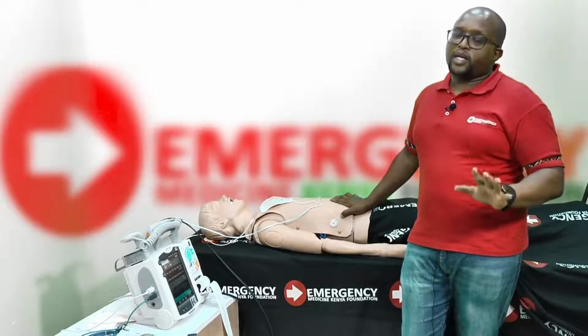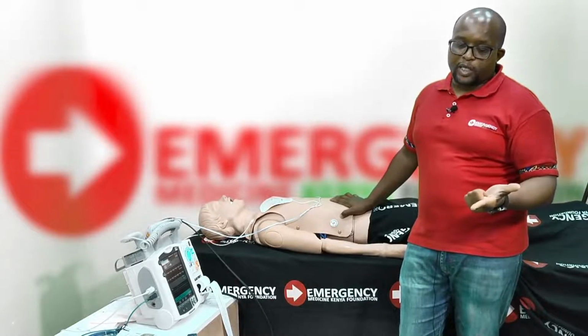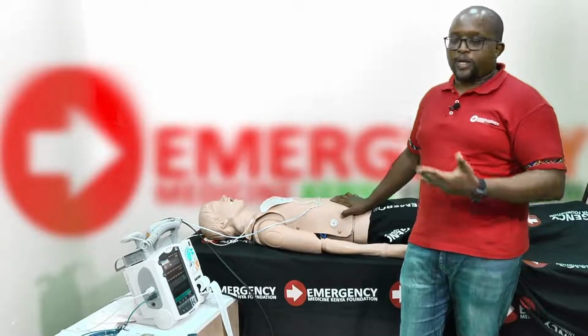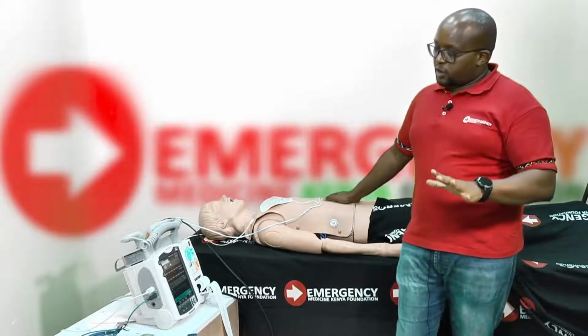Okay, so remember, key things: indication is bradycardia, heart rate less than 50, hypotension, a patient with features suggestive of shock, which includes hypotension, chest pain, shortness of breath, and cool clammy skin. And then you mainly need to make sure you're going to the pacer mode.